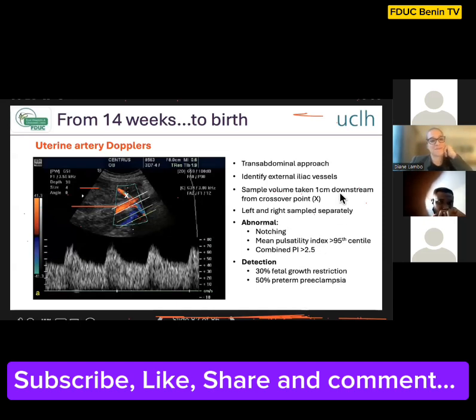And when you identify uterine artery Dopplers that are abnormal, and I'm talking about mid-trimester, so I'm not talking about first trimester uterine artery Dopplers or third trimester uterine artery Dopplers, but mid-trimester abnormal uterine artery Dopplers, then generally speaking, the likelihood of that pregnancy being complicated by fetal growth restriction is about 30%. The likelihood of that pregnancy being complicated by preterm preeclampsia is about 50%. And really, at this point, there's not much that you can do. We know that aspirin after 16 weeks doesn't work. And so really what it's about is surveillance.